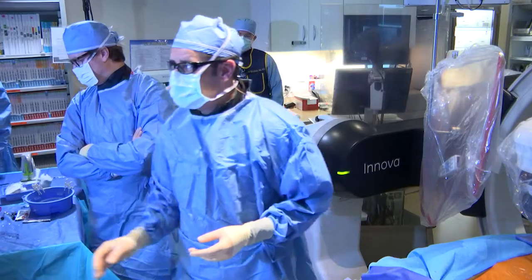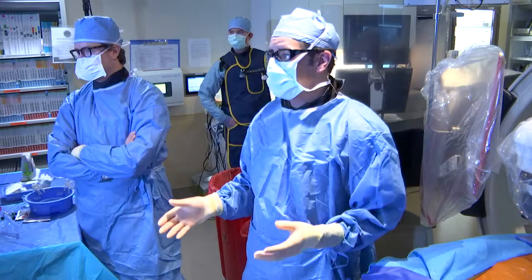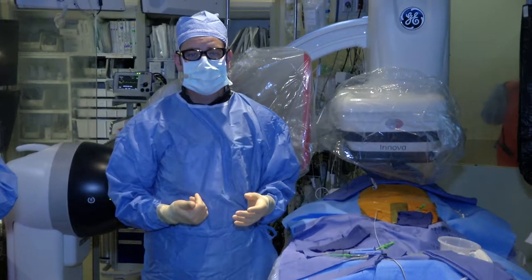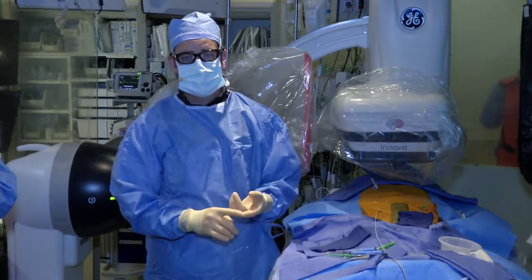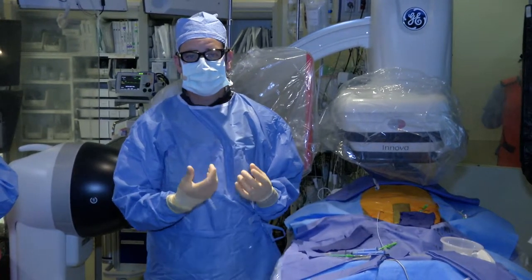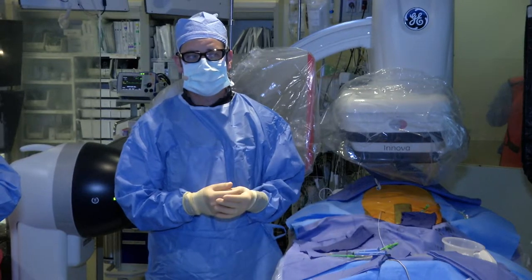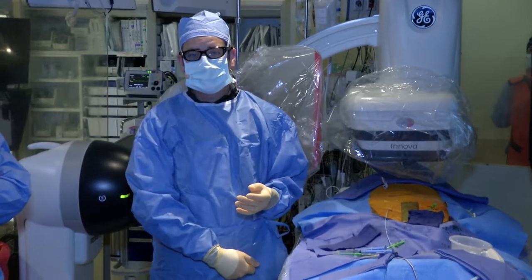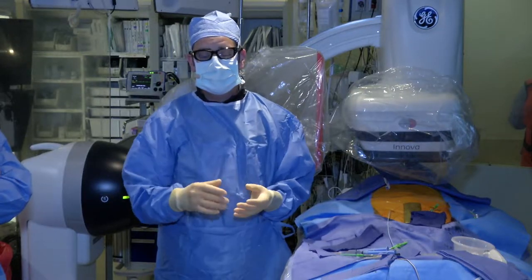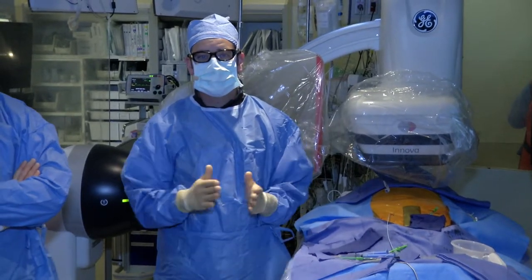Thanks. So what we've done so far, the patient is going to have 2 access sites. One site is for the actual valve delivery system to go through, and the other side is going to have 2 things. One, an arterial access so that we can put a catheter up to inject dye and give us visualization of what we're doing. And the other access is going to be the vein so that we can put a temporary pacemaker, because when we deploy the valve, we're actually going to temporarily pace the heart very quickly.